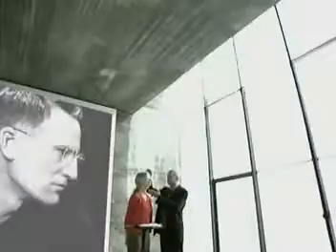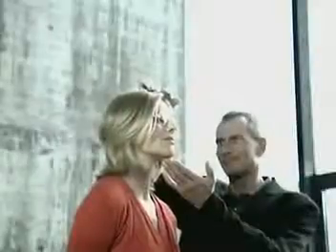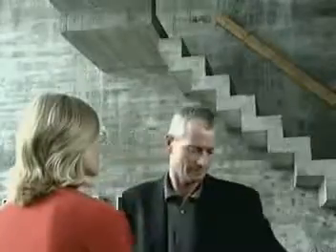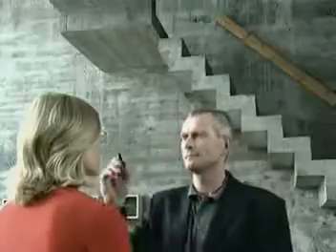You can naturally determine the pantascopic tilt of the pre-fitted frame with the method of your choice. We would like to show you a simple method to determine the pantascopic tilt not in degrees but in millimeters. First, mark the point of vision on the lens with the eyes looking straight ahead and the frame plane in the perpendicular position, as when fitting aspheric SV lenses.